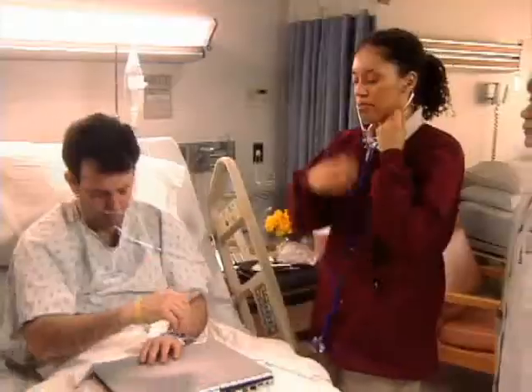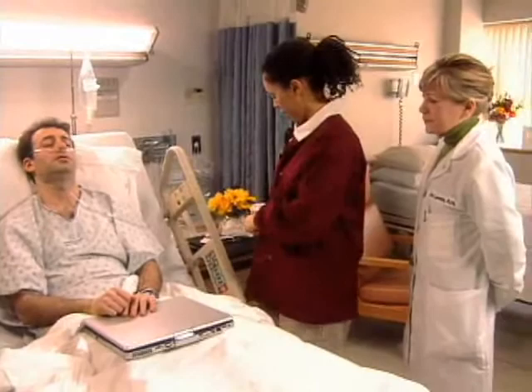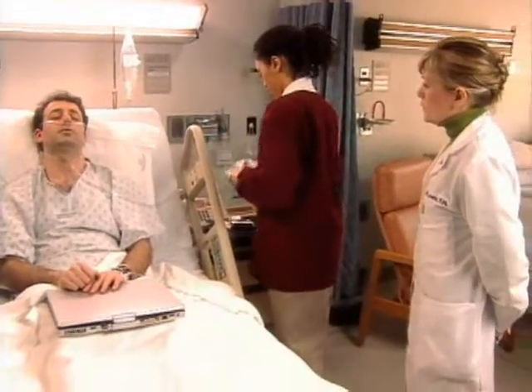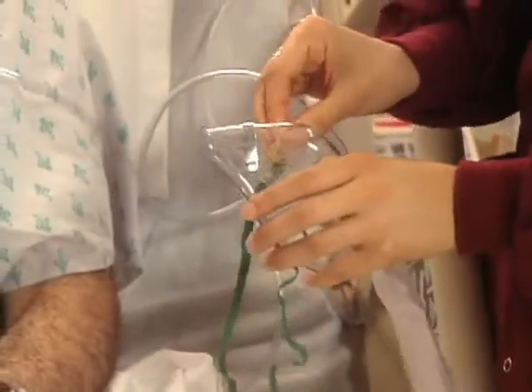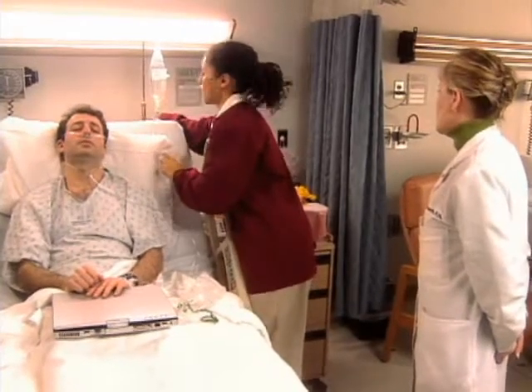Okay, Mr. Simon. We're going to get the face mask connected to the setup, okay? Okay, remove both flaps from the mask. All right, I'm just going to lay this right next to you.